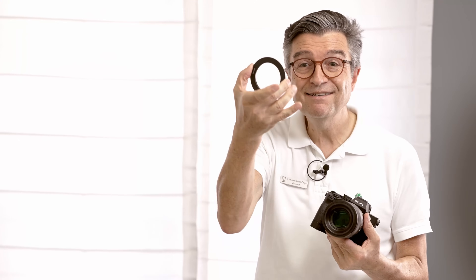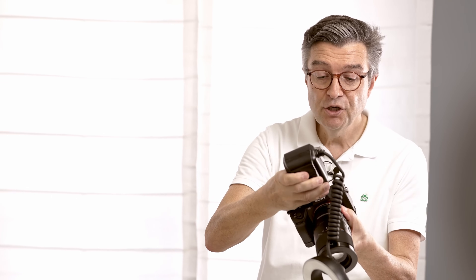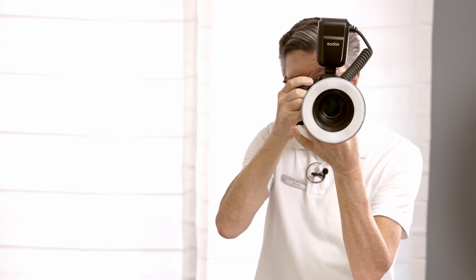We have selected the correct adapter ring — in this case, the 62mm. We mount it to the lens. We attach the flash on the hot shoe, click it in, and then slide the flash onto the ring. Ready to shoot.